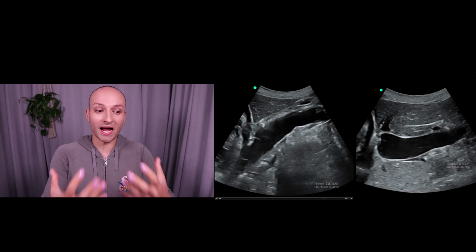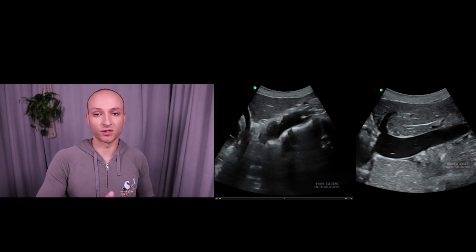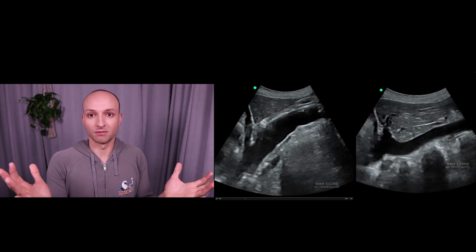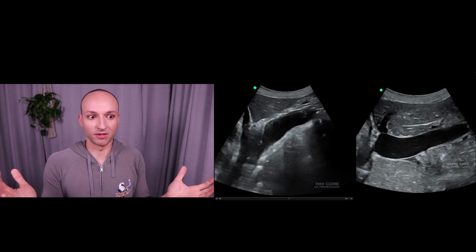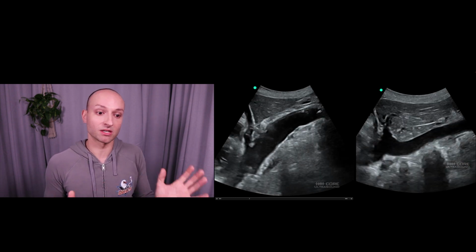So usually the way that I differentiate them is, first off, I place it in cross-section first, in transverse, and just look. The one on the left is the aorta in a normal, non-situs inversus patient. The IVC is going to be on the right and the aorta is going to be on the left.